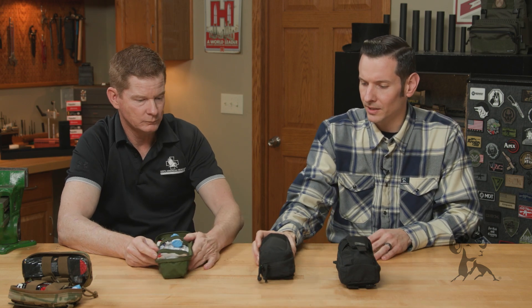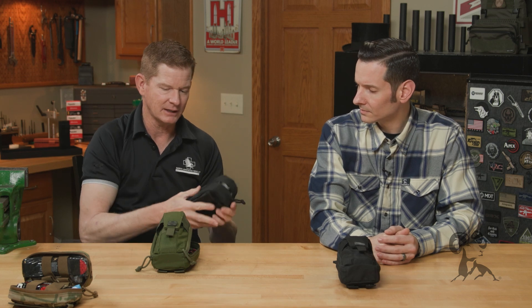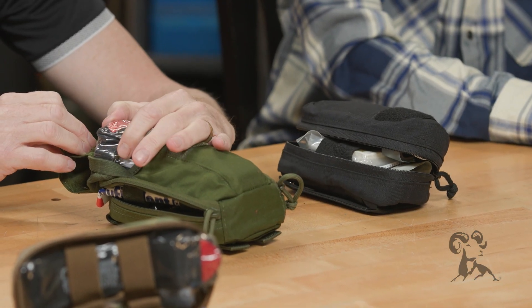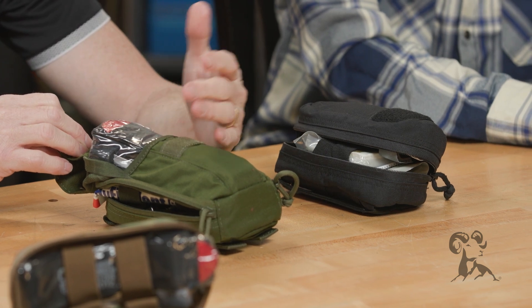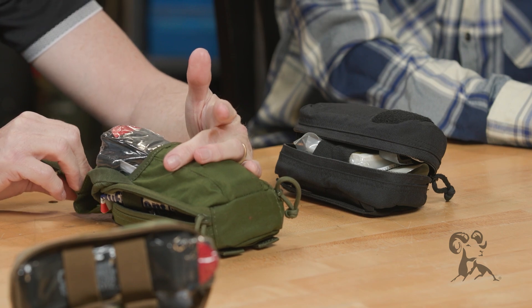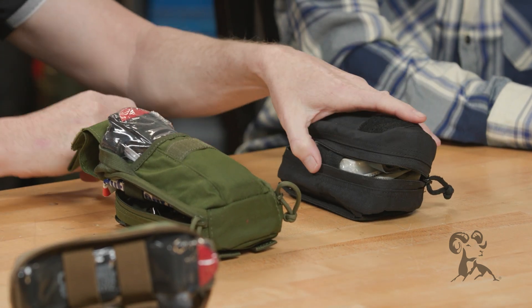We also have some other kits. This one here looks different, but the only difference between these two kits is they have the same exact items — on the inside, you're going to have the tourniquet on the inside instead of on the outside in the pouch. So if you do a lot of shooting by yourself and you have this on you, it's going to be easier to get into your kit by just pulling the flap up and getting to your tourniquet than it would be to unzip.